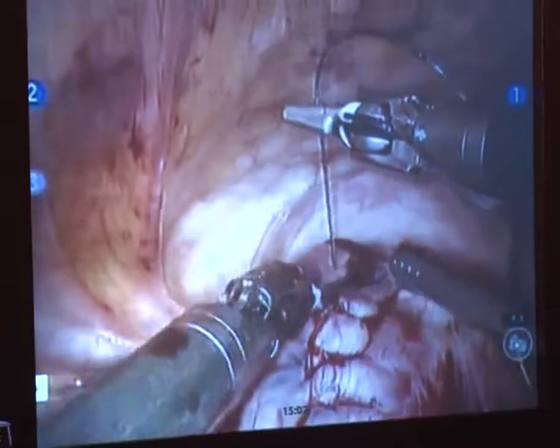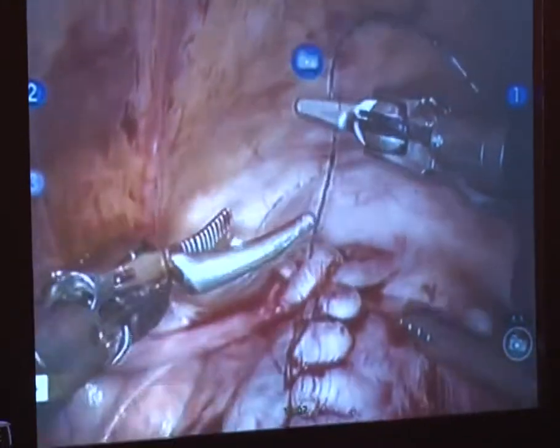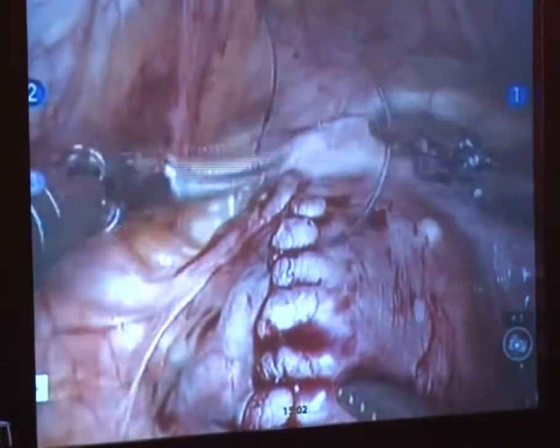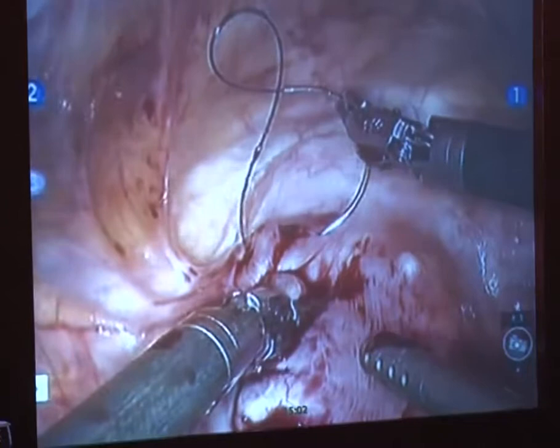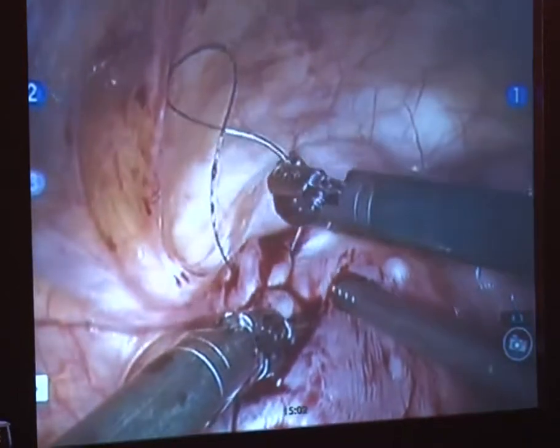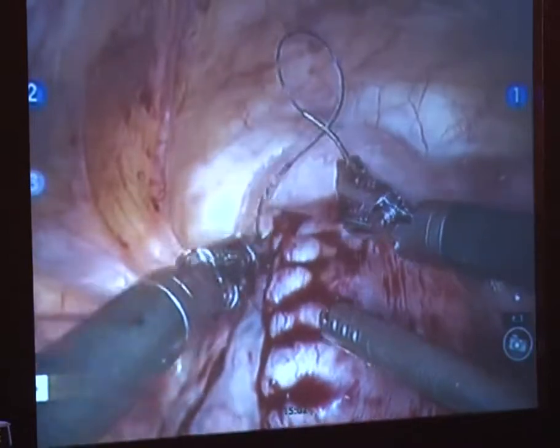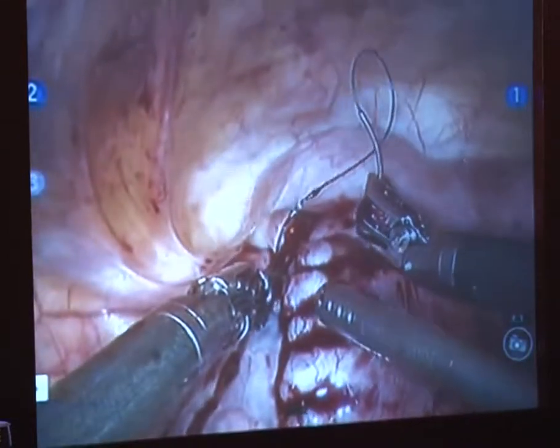I'm doubling back now that I've gotten my corner, so I can lock this. Artie, the discussion in here was on the relative necessity of adhesion barrier with myomectomy. In other words, how necessary do you see it in the global perspective of things for myomectomy per se?